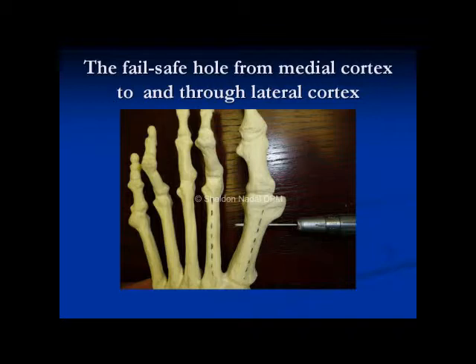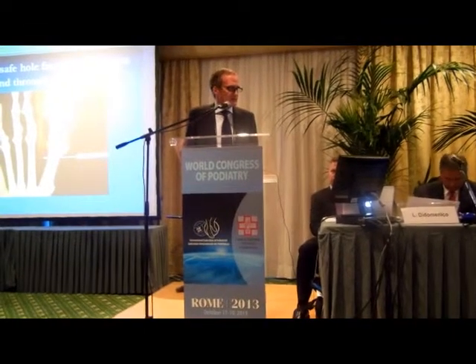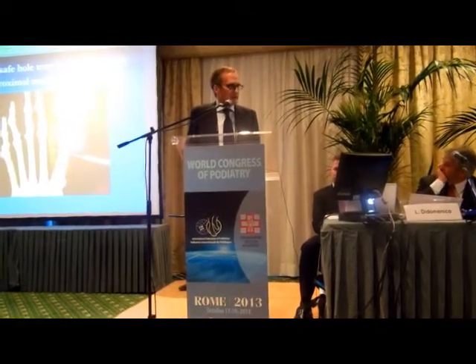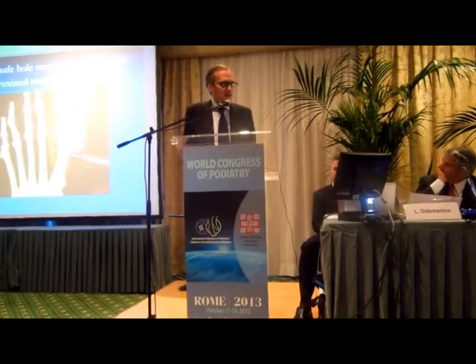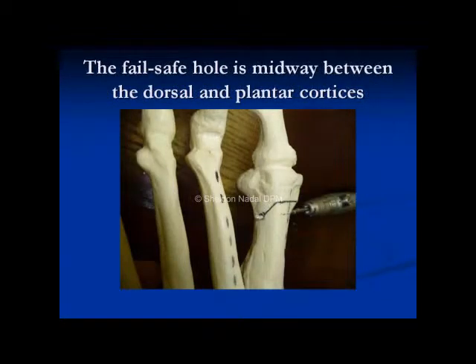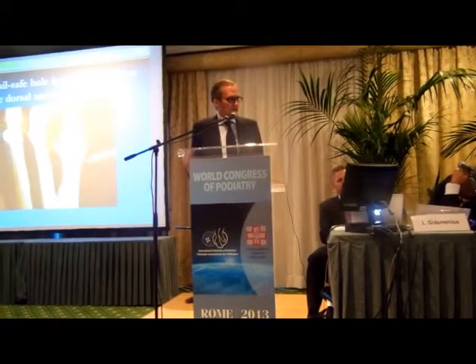the long axis of the second metatarsal, because that is the long axis of the foot for all intents and purposes. You can change the osteotomy angle from proximal medial to distal lateral to reduce shortening, but you'll find it is more difficult to displace the metatarsal head laterally if you do that. So here we've done the fail-safe hole from medial to lateral, from the medial cortex through the lateral cortex with one burr, and then we switch burrs.